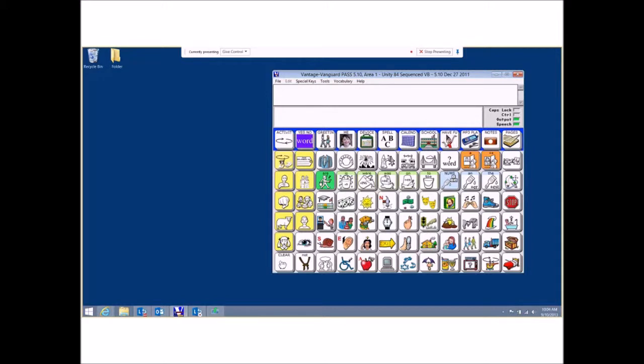Please let me know what questions you have. And again, just a quick introduction to what the parts of the device are and essentially what you need to know to allow him to use the device in class.